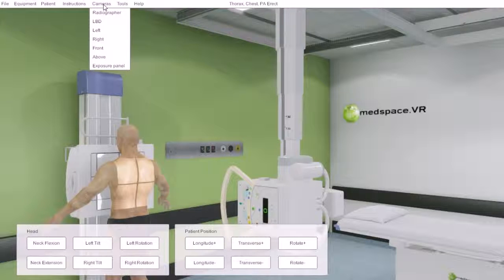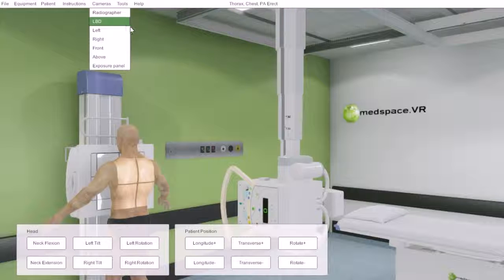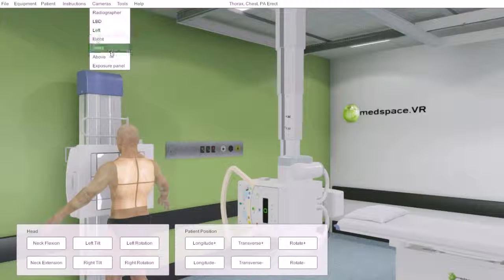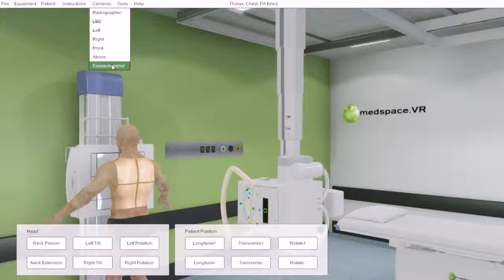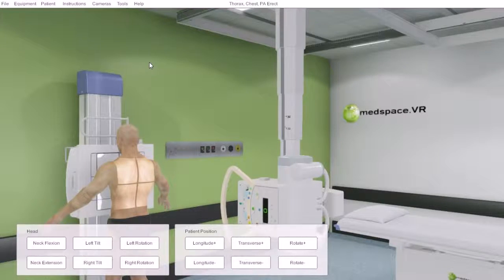We can also move around the room as a first-person radiographer or view from different angles. These all have different hotkeys, which we will go into on individual components.